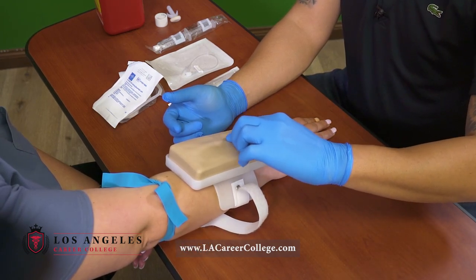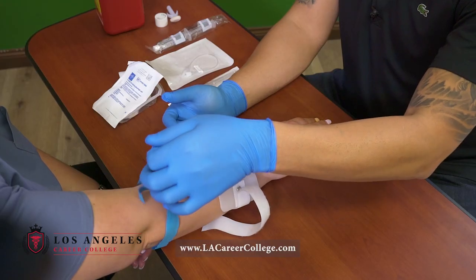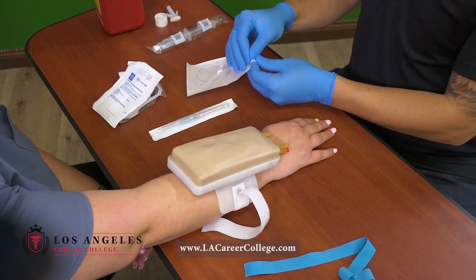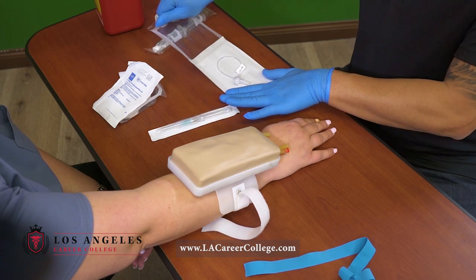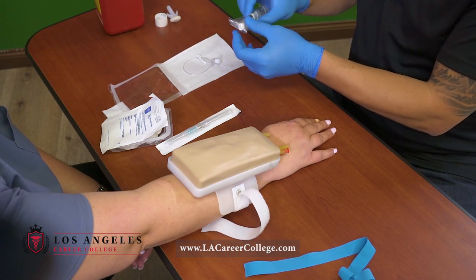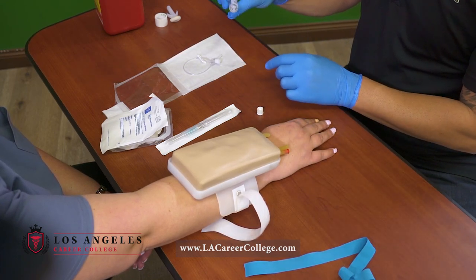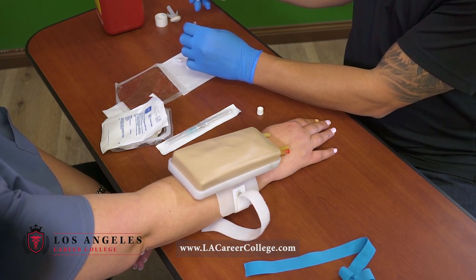So I'm gonna go ahead and look for a vein. I've identified my vein. I'm gonna go and release my tourniquet to get my equipment ready. At this point in time, I will go ahead and open up my extension tubing. What I like to do is create a work area, kind of like a barrier. Starting an IV is a clean procedure. I will go ahead and take off the normal saline, check the expiration, and connect it to my extension tubing.